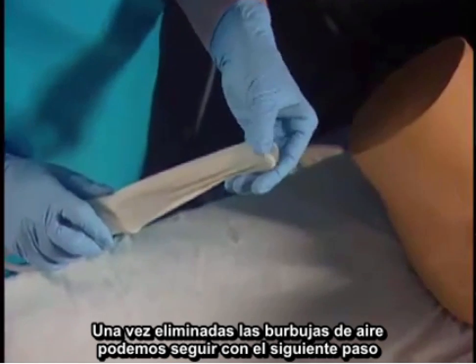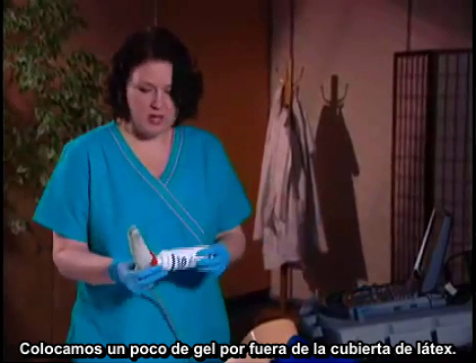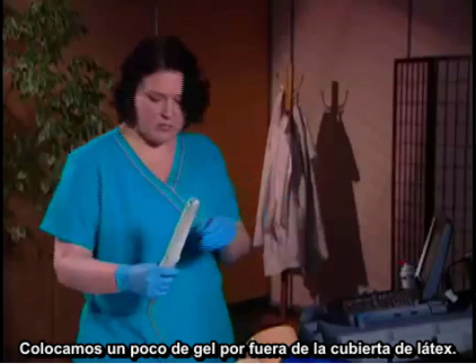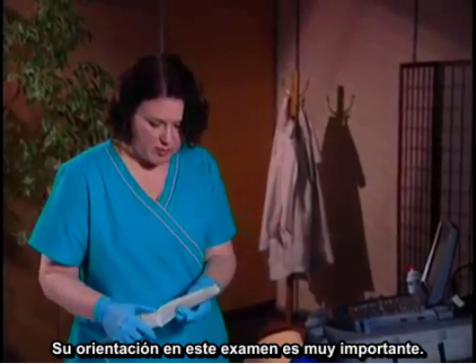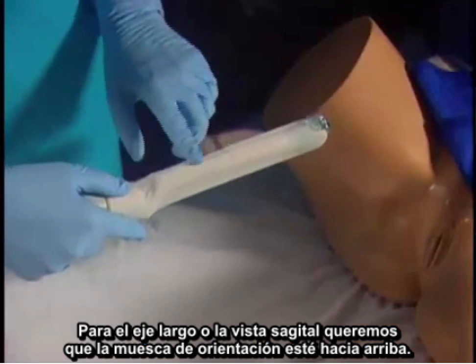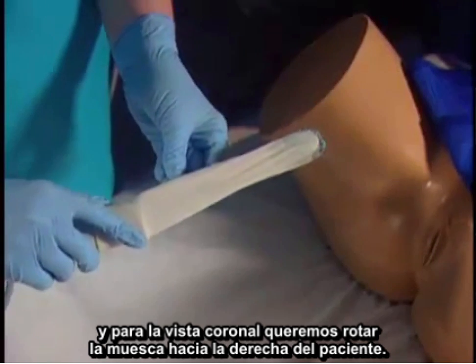Once you've got the air bubbles eliminated, you can move on to the next step. We're going to put a little bit of gel on the outside of the latex cover. Orientation for this examination is very important: for the long axis or sagittal view, we want the orientation marker up, and when we go to the coronal view, we turn it so it faces the patient's right.